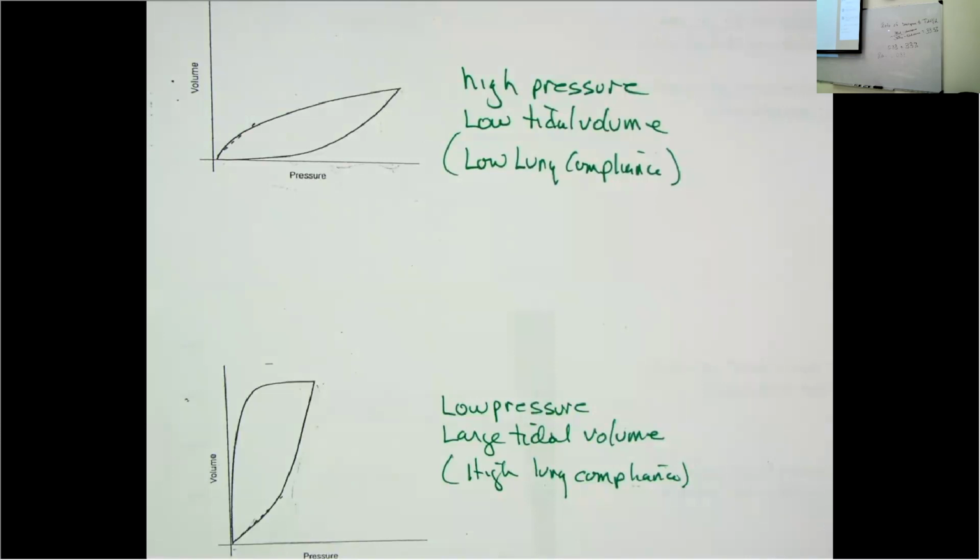So the bottom is during inspiration, right? The line, the baseline. That's the pressure. It might be easier to look on your paper so I can point to it. So that's the pressure, right? As it goes higher, that's more increased pressure. This is inspiration.